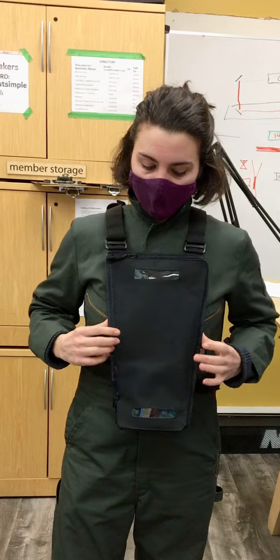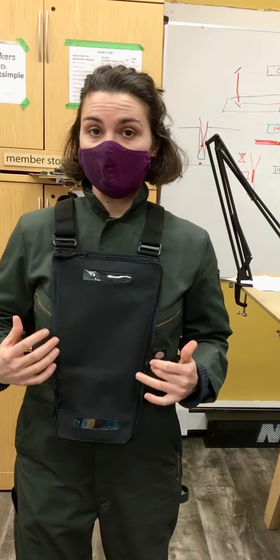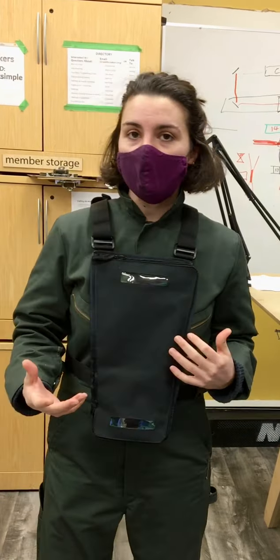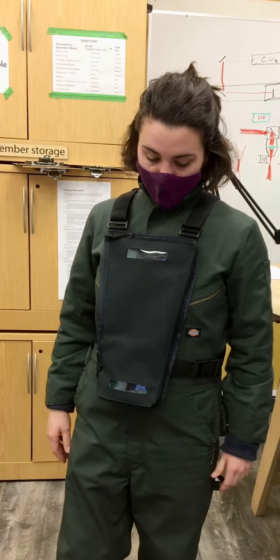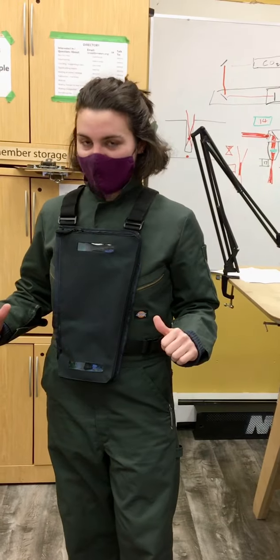This is just a prototype, so we're going to be perfecting the design, making it a little sleeker, more user friendly, more comfortable. But so far, this is what we got going on.